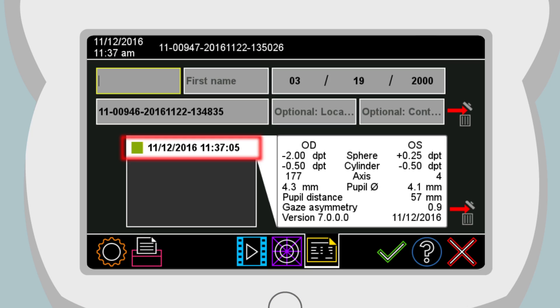Green entries show successful measurements. Aborted measurements are not portrayed.